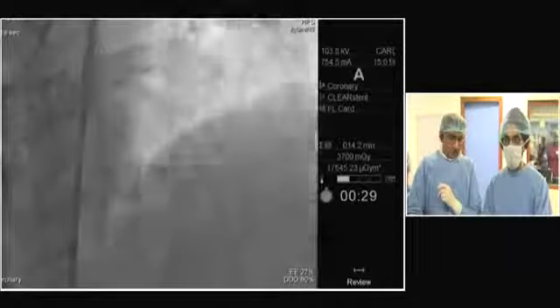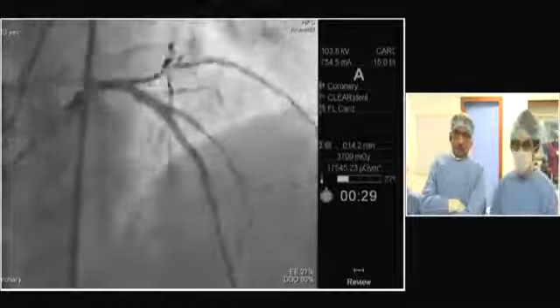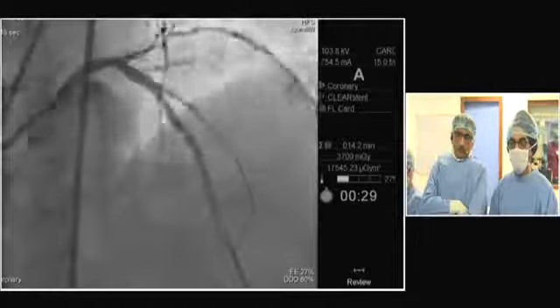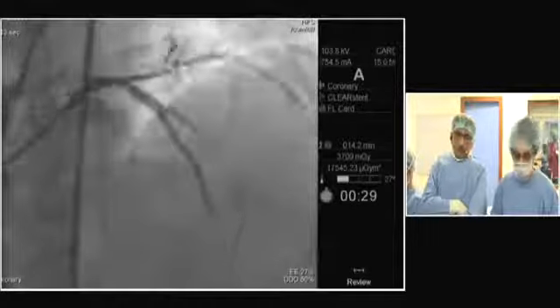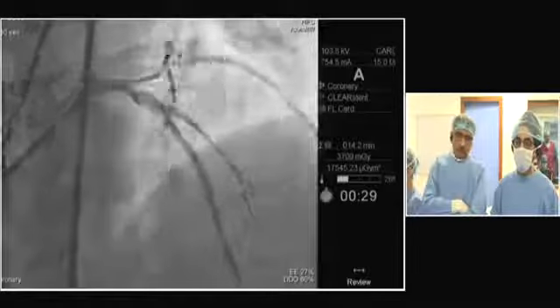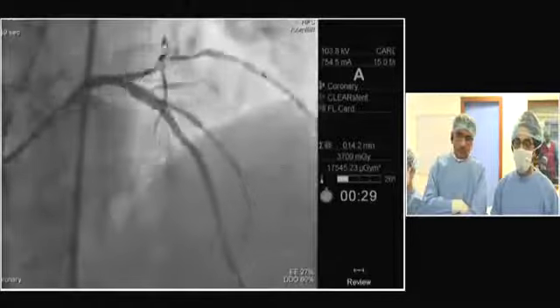So one point here. I think it's also very important to make sure that we have at least 6, 7, 8 millimeters of stent in the proximal main vessel, so that we have room to do the POT. Because if we do the POT within a 3, 4 millimeter stent in the main vessel, then we end up injuring an uncovered area of the main vessel, which may be a reason for stent restenosis.